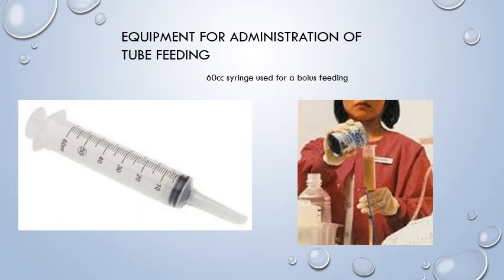For a syringe bolus tube feeding, the delegating licensed nurse will provide DD personnel with specific intermittent tube feeding instructions. These instructions should include type of supplement, amount of each feeding, number of feedings each day, duration or how long the tube feeding will last, times of the feedings, and tube feed flushes or the amount of water before, during, and after each tube feeding.